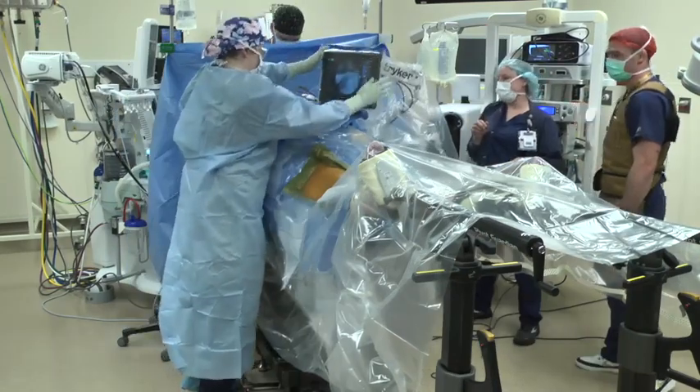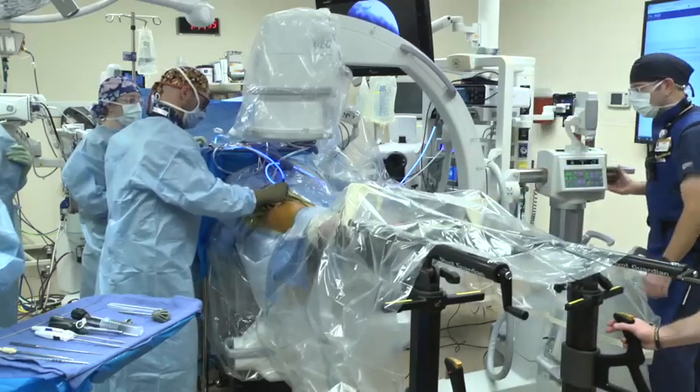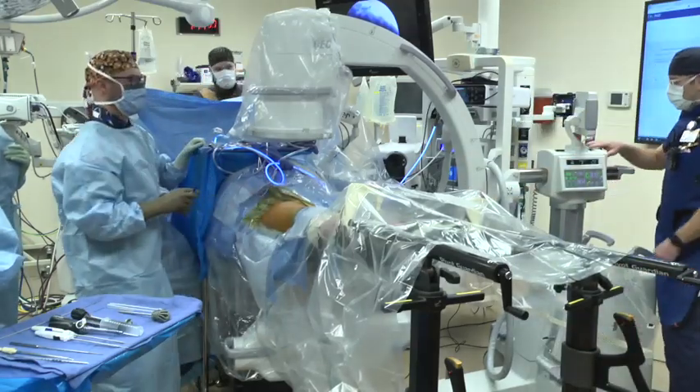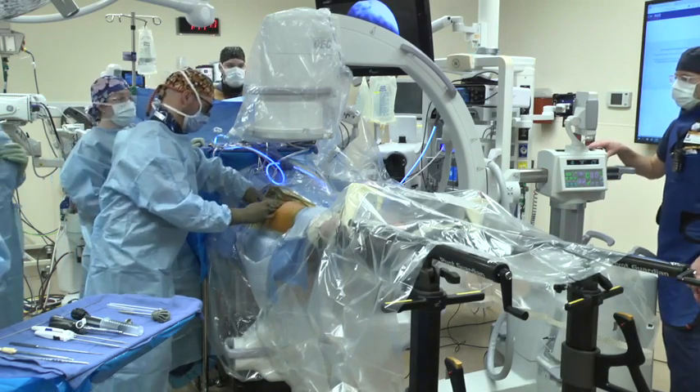The arthroscopic tools and tower are assembled. Bony landmarks are once again palpated and marked, including the ASIS, iliofemoral line, and greater trochanter. The arthroscopic portals are then provisionally marked.